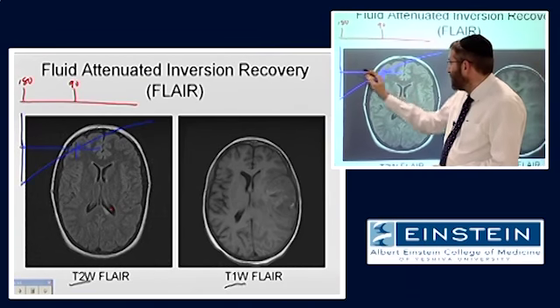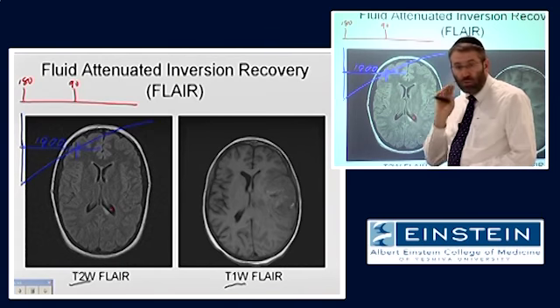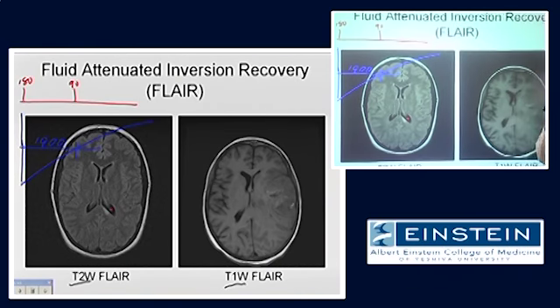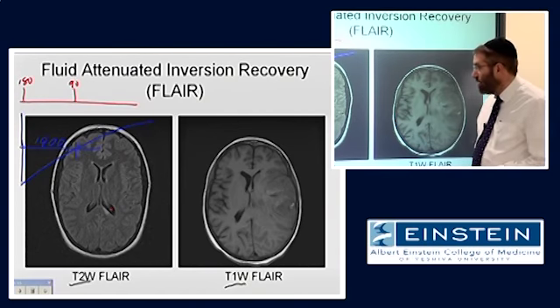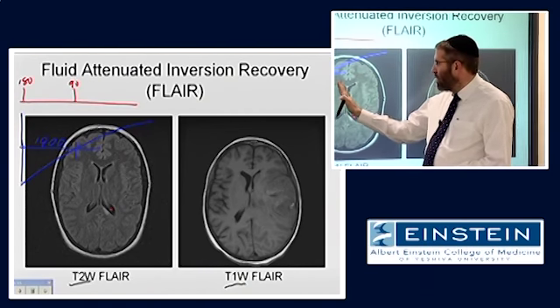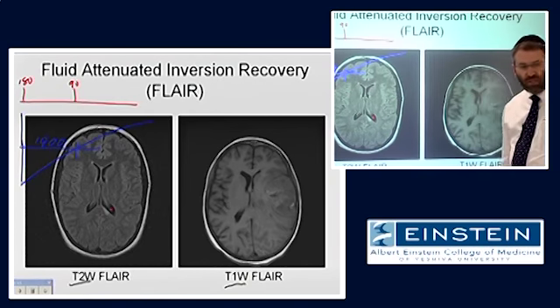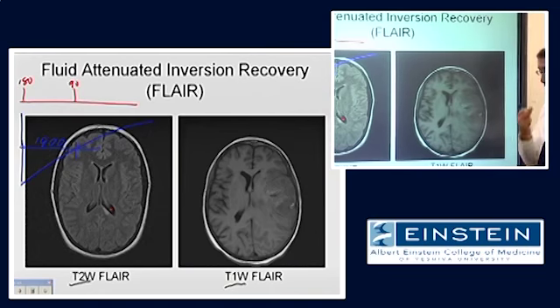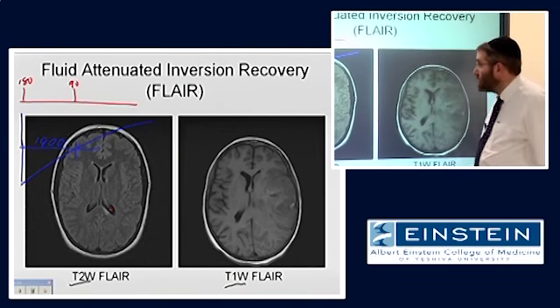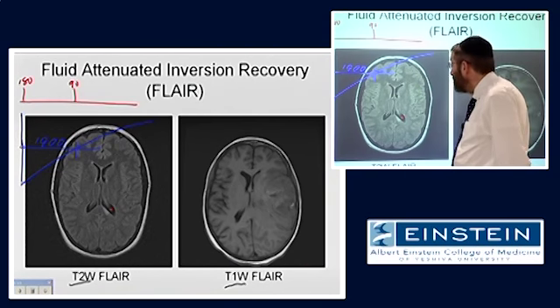This inversion delay here at 1.5 Tesla is on the order of close to 2 seconds. Okay? Then in this image, while we do want the inversion recovery to null CSF, we're really interested in predominantly T2 contrast. So these are done with a very long TR.